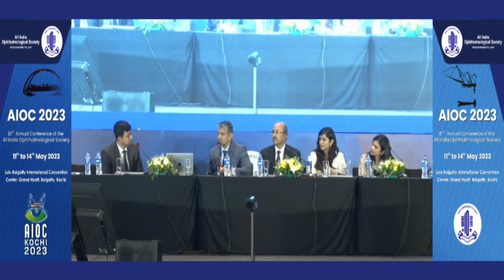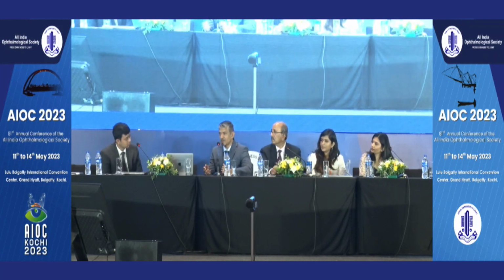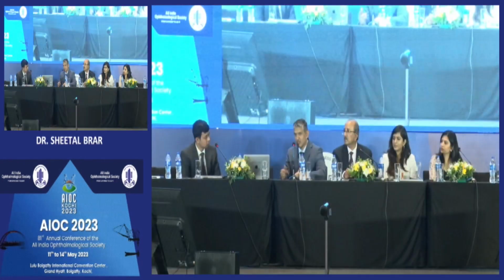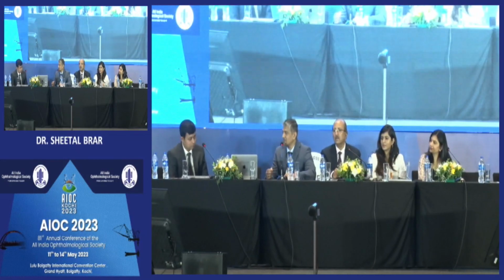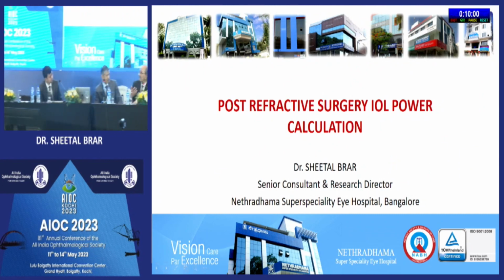Okay. It's not that you cannot adjust it. Like you saw in the video, I went below. With the Femtis, what happens is you need a femtocapsulorhexis, a very precise capsulorhexis, and once you capture the lens, you can't go below the lens. So if you have any retained viscoelastic, then you can have an IOP rise. Whereas with this lens, even with a manual rhexis or a femtorhexis, if it's around 4.5 mm, you can capture the capsulorhexis, and you can go below, remove all the viscoelastic. You can make some adjustment, but it is anchored, so it does not easily rotate, and it is quite stable.